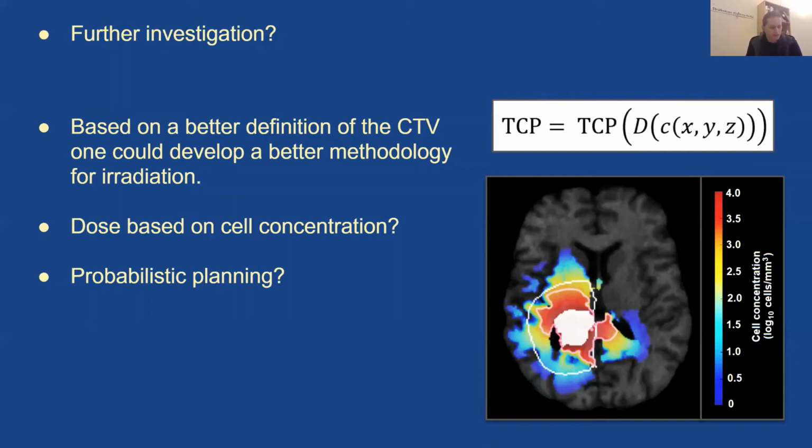It's perhaps easier said than done as well, because there haven't really been many tools for this so far. But it seems that today, especially, we have more and more tools to be able to not only segment the tissue easier, but also to do these algorithms, which can actually give this CTV this kind of shape. But it's something that we need some actual experimental results before I think we actually do.